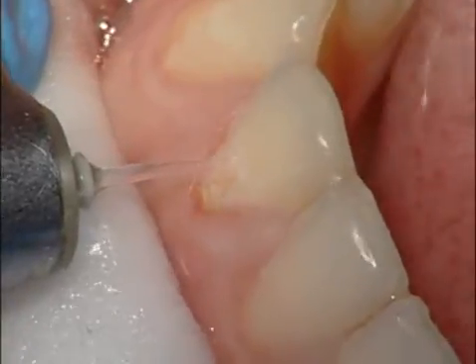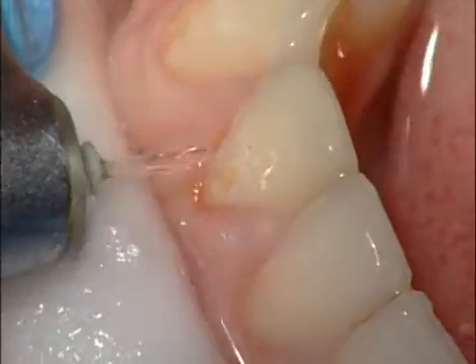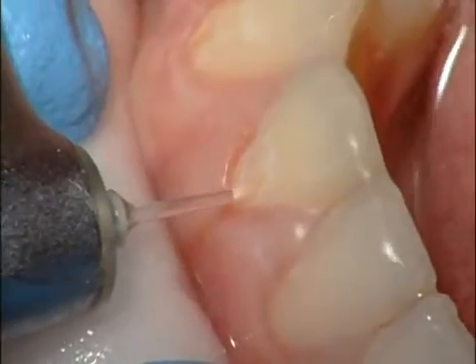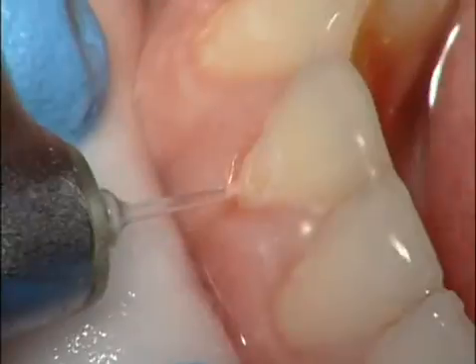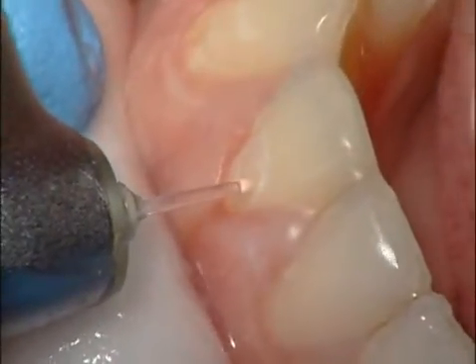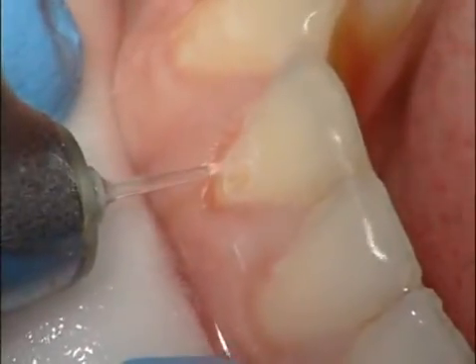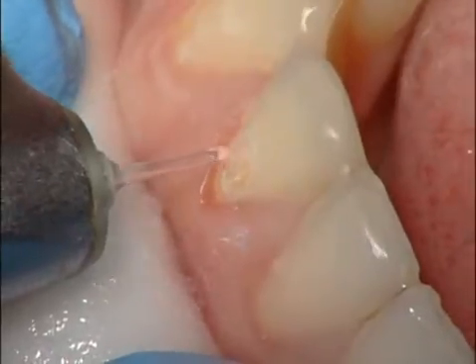And in all these procedures, I've previously done the laser anesthetic technique that we've talked about. It's also important to remember that the longer you use the laser on the tooth, the more it desensitizes, to allow you to go in with spoon excavators and slow speed round burs comfortably for the patient.